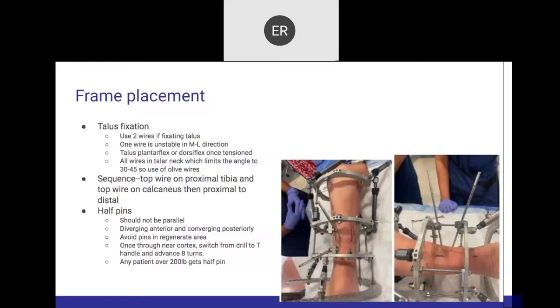For wire fixation on the talus — to prevent anterior and posterior translation that could happen in ankle fusion — two wires to fix the talus will be sufficient. But those will be at 45 degrees, basically at the neck of the talus. It's very important to do that to prevent any plantar or dorsal flexion when you tension them, as this could affect overall alignment of the extremities.